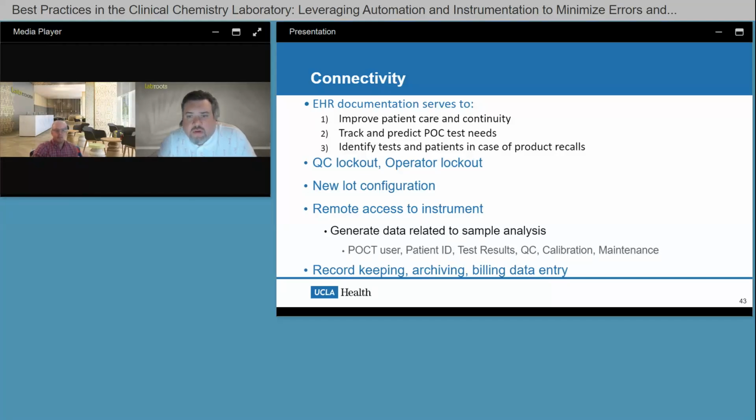All right, thank you. Next one we have here is why do we have to test a venous and arterial blood gas for a newborn baby? I don't have the exact answer to that, but I would say it depends on what sample they can collect and what is the easiest sample of collection there.